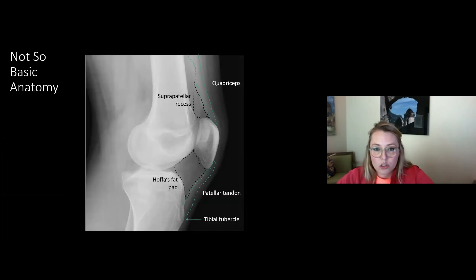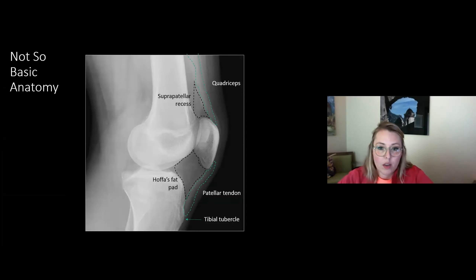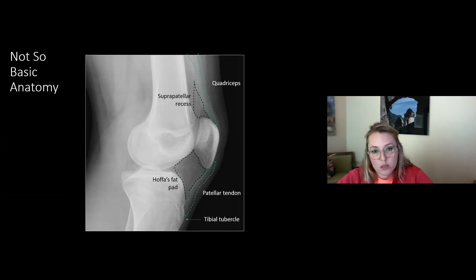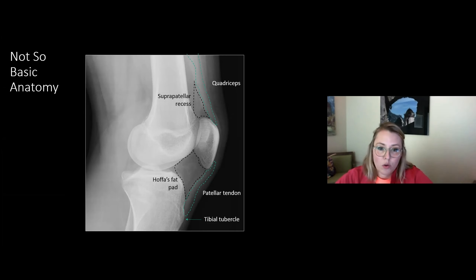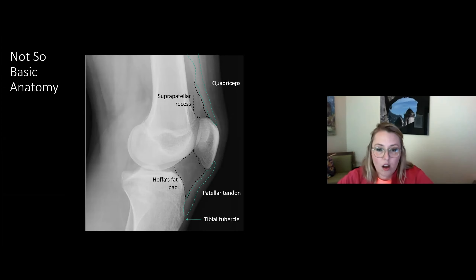The lateral view gives you a window into the soft tissues of the knee. With an appropriately exposed radiograph, you get a nice look at soft tissues. The gray shadow at the top of the patella is the quadriceps tendon, and right behind it is the suprapatellar recess — a potential space where joint fluid accumulates; this is where you look for joint effusion. Down below, the diamond-shaped gray area is Hoffa's fat pad. If it looks too white, that can indicate edema related to injury or inflammation in surrounding structures.